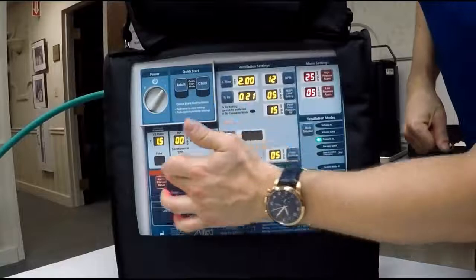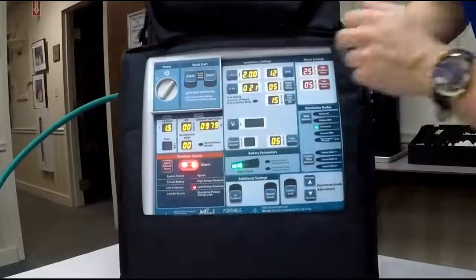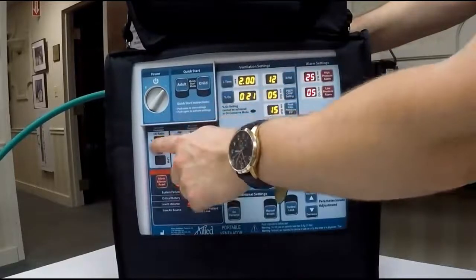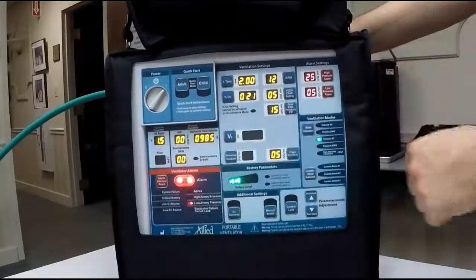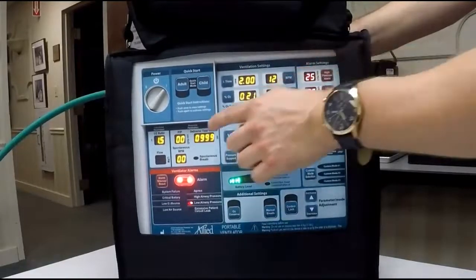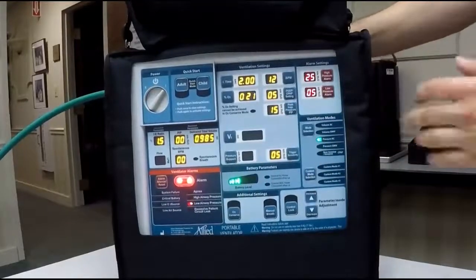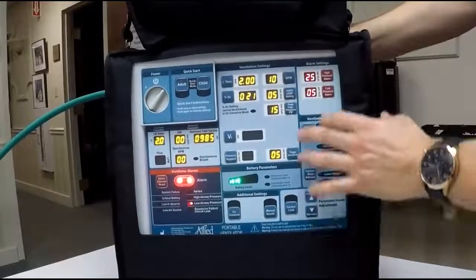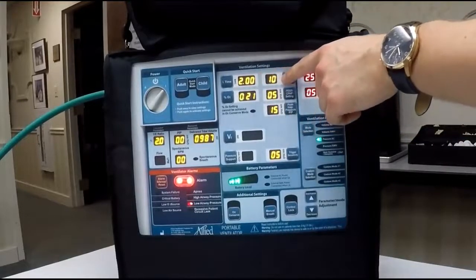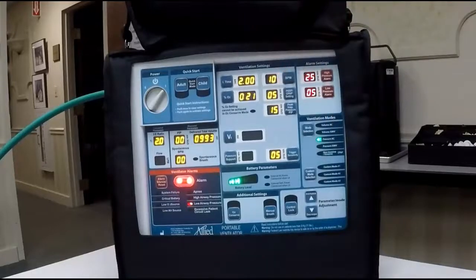And then lastly, you do have your readout screen. So right here, you'll see at the top, this is measured parameters and this is calculated parameters. So your calculated parameters, which is your IE ratio, this is 1 to 1.5. So that's based on your I time that you set and your breaths per minute. So if I want this to say 1 to 2, which would be 1 second inspiratory time, 2 seconds expiratory time, we decrease this down to 10, because now you're giving the patient 2 seconds to inhale, 4 seconds to exhale, that's 6 seconds of breath, times 10, that's 60 seconds in a minute.